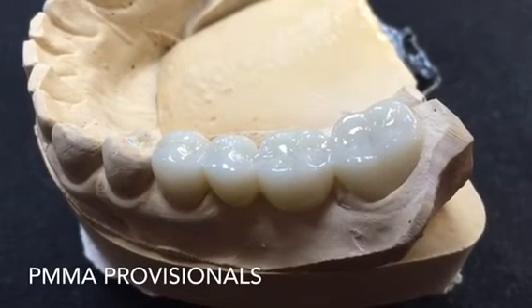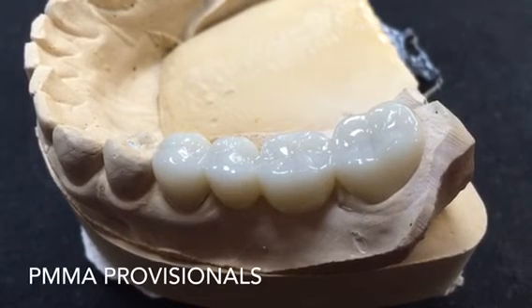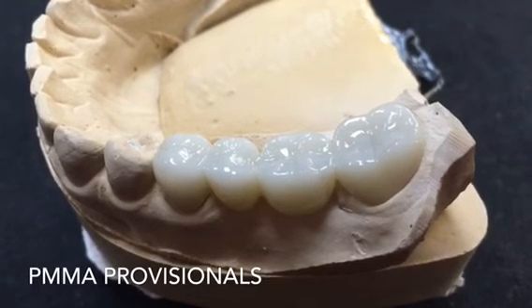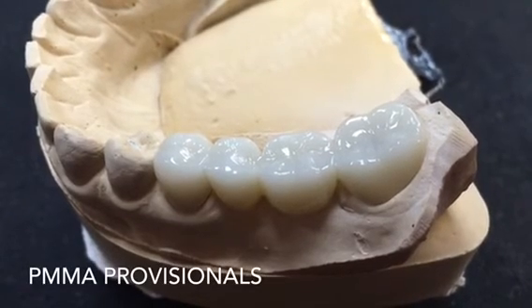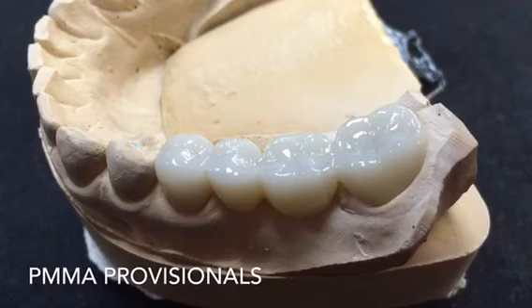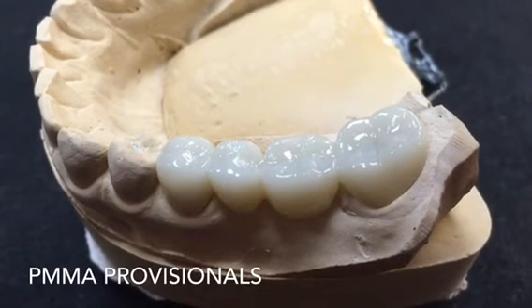These are great for long-standing temps — great for temporaries where the patient has to go for periodontal surgery with extractions and implant placement, or even extractions with bone grafting where we allow the tissue to heal for four to six months, then come back and place implants, let them integrate, and then go to final restoration.